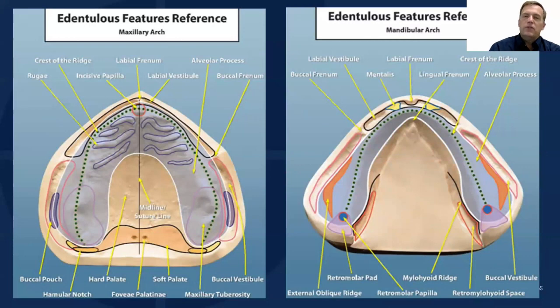I want to take a minute to talk about denture borders, because they're so important for stability. And again, they're one of those things that you guys know backwards and forwards, because you see the movable tissue and you see the stable tissue. On the model, it all looks pretty stable. So our technicians are trained to recognize different landmarks, but sometimes you can help.